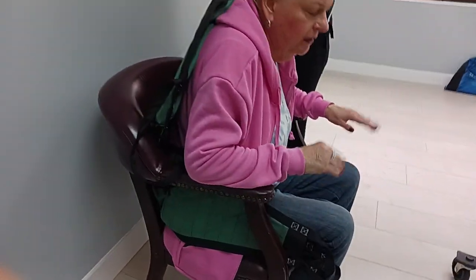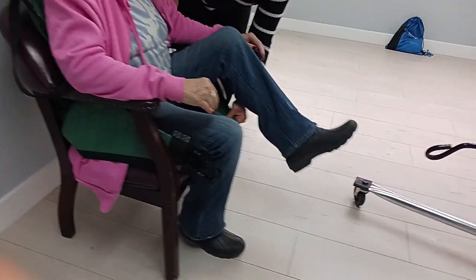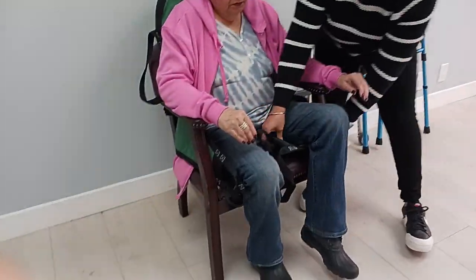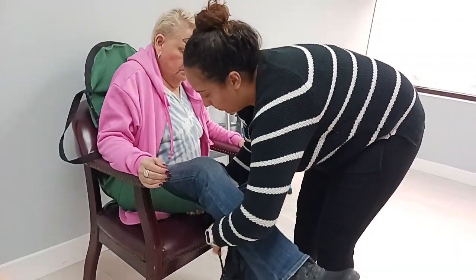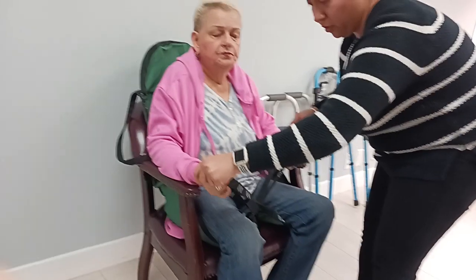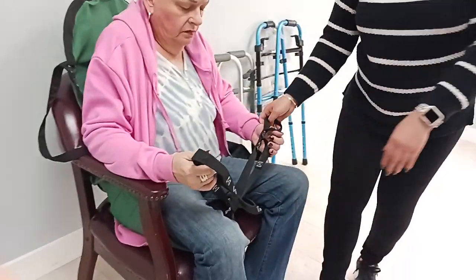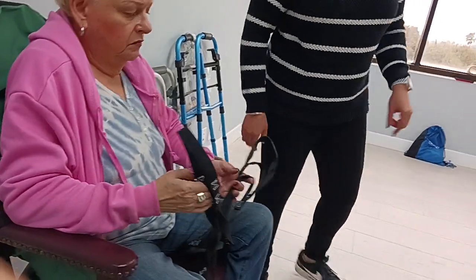So it's just in contact with the chair as low as you can get it. And then these go down the side and under the leg, and they need to cross — so this one and then this one, and they would cross. This handle is for the patient — that's for them to hang on to? No, they don't hold it. We'll show you.